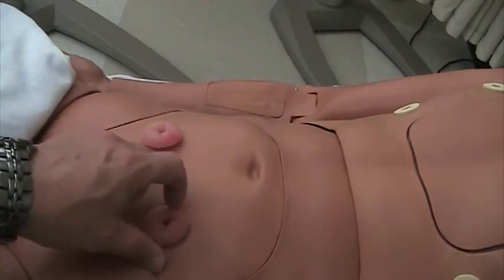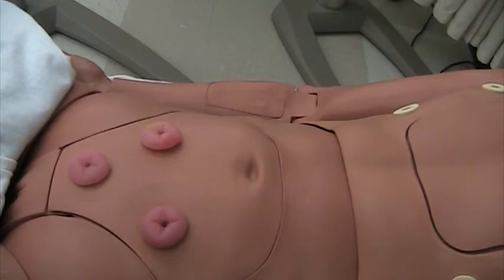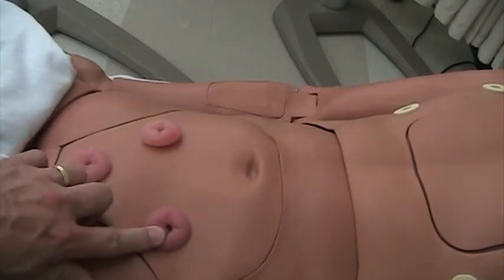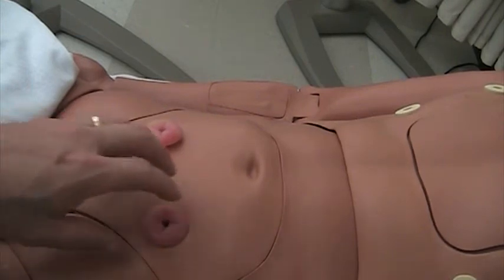So we have to make sure we have good skin integrity around the stoma. Stoma should always be pink. It should never be yellowish. It should never be bright cherry red or black. Okay, so a pinkish color is what you're looking for. The other things can signify strangulation of the actual stoma, which causes lack of blood flow, so it would become pale, and then it would turn a bright cherry red in one spot, not the whole thing, and then it could turn black. Okay, but we've got to have a pouch here to capture whatever's coming out.